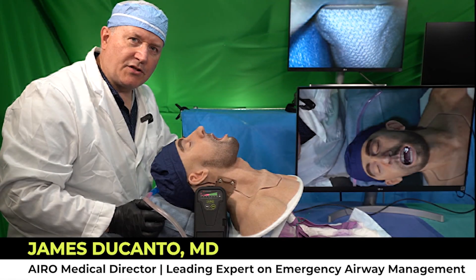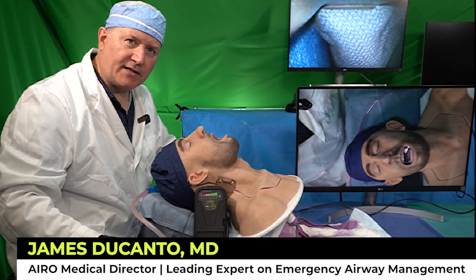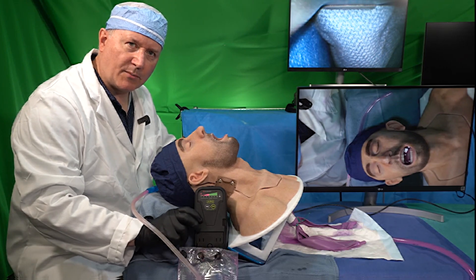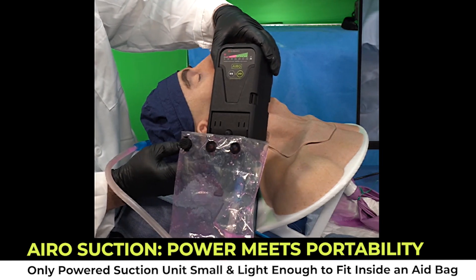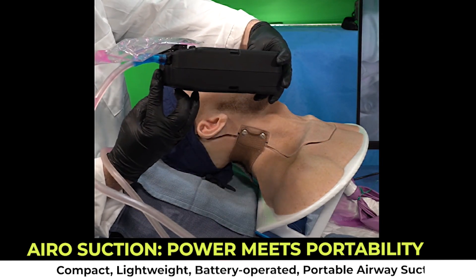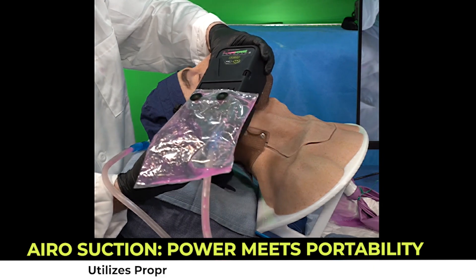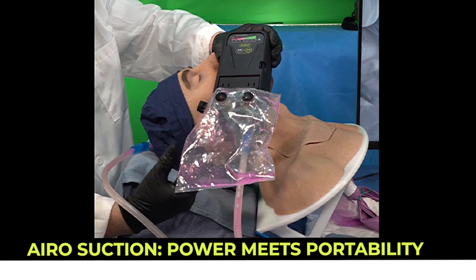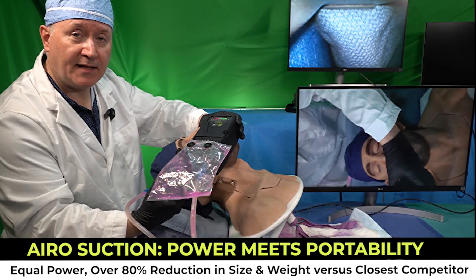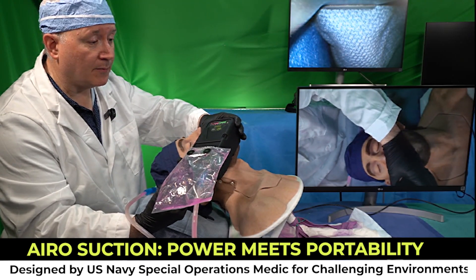Hi, it's Dr. Jim DuCanto. I'm here to show you the SALAD technique with a brand new suction device that's going to enter the market very shortly. This is the AIRO suction device. It's a compact, lightweight, battery-operated suction unit that utilizes a small flexible bag in lieu of a rigid suction container, and what this does is it reduces the size and the weight while maintaining the power of a suction unit needed in the pre-hospital and military environments.